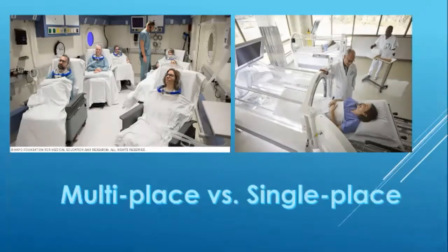This is what it looks like. This is the multiplace that I was just talking about. It looks like a ship, like a submarine, okay? The windows are back, the hatches are battened down really strong because of the high pressure. The patients, look at them. They're all on oxy hoods. They have an oxygen hood on.